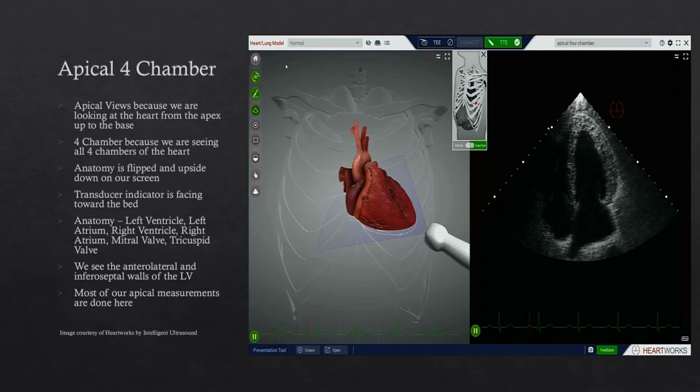Sometimes you can use the bed to kind of anchor your hand, your shoulder, and arm down, and then use your finger up around the bottom part of the transducer to anchor your hand to the patient's chest. But it's difficult sometimes because we are moving around on ribs and things like that down there. So it just takes some practice in order to be able to keep that transducer in one spot without sliding down there.